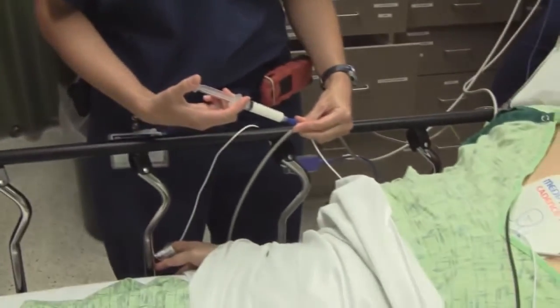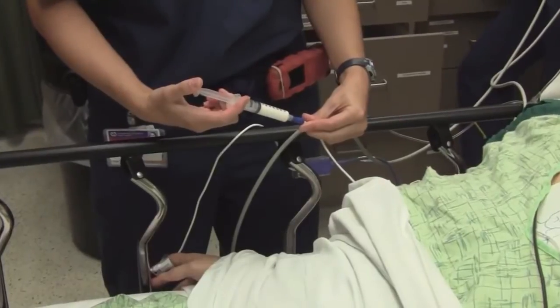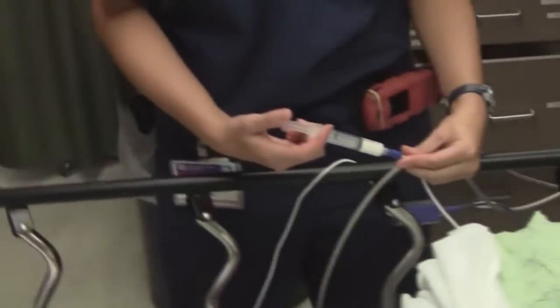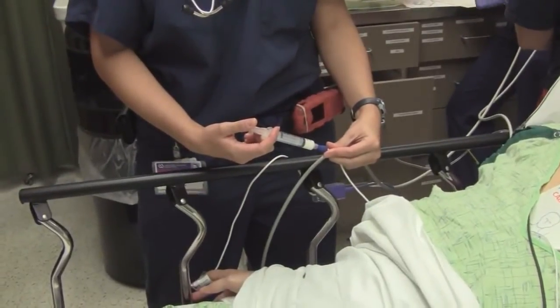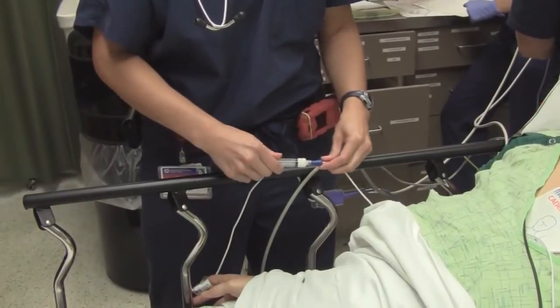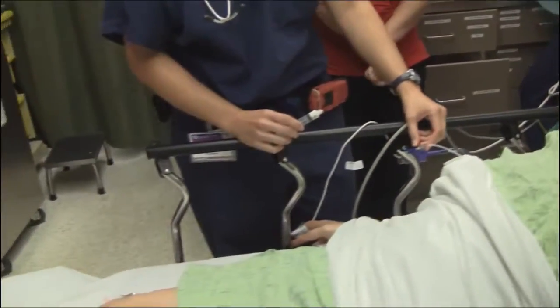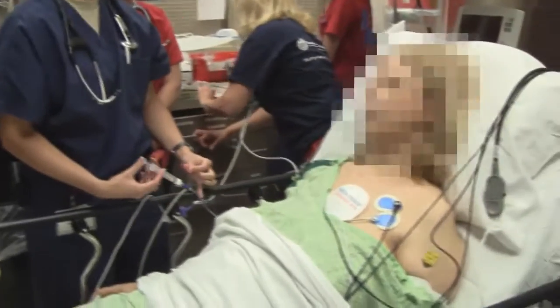Here we go — it's game time. Sleeping time. Jessica, tell me what you're doing. I'm going to give her one milligram per kilo of propofol. When do I start the burning? Any moment — you may be one of the lucky ones that doesn't burn. It just feels full. One more — I'm going to give the other 20 and then leave the rest.